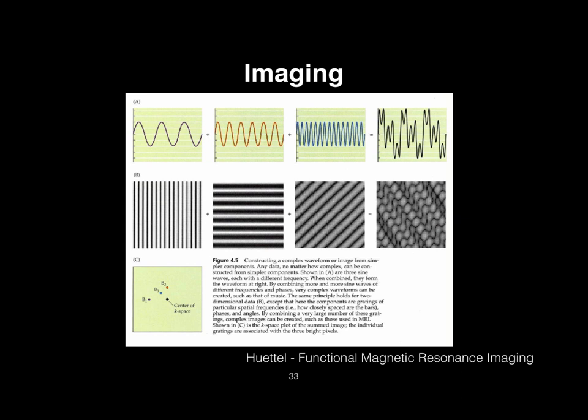So if we were just looking at variations along the x dimension, A would probably be somewhere here, B would probably be somewhere here, and C would be somewhere here, as we go across. It just means you're getting out to higher and higher frequencies along your horizontal dimension.